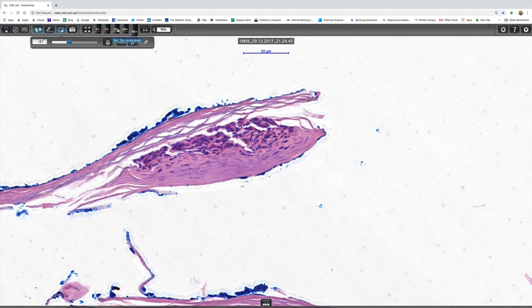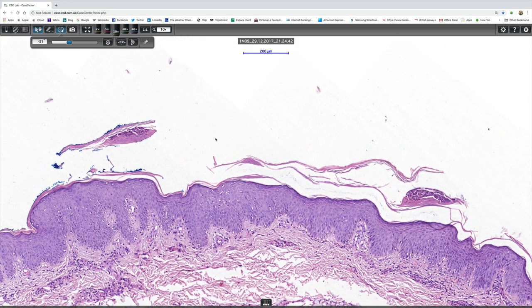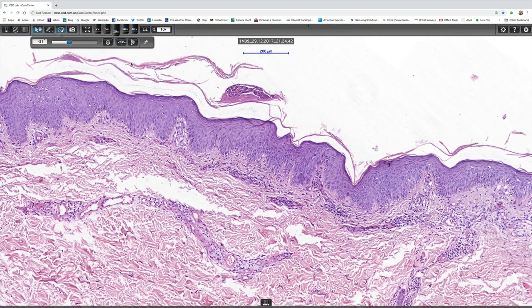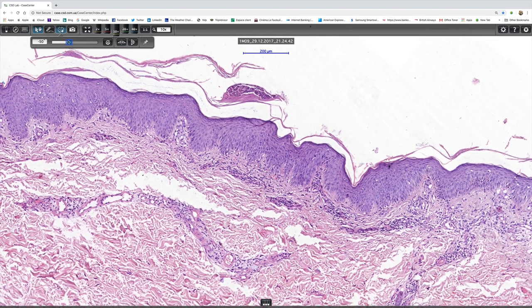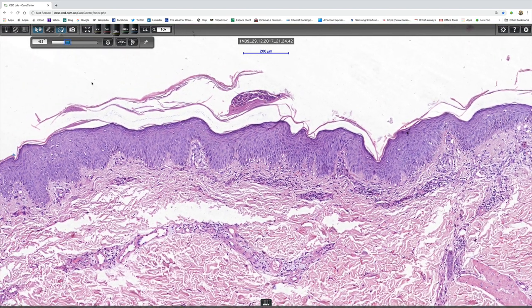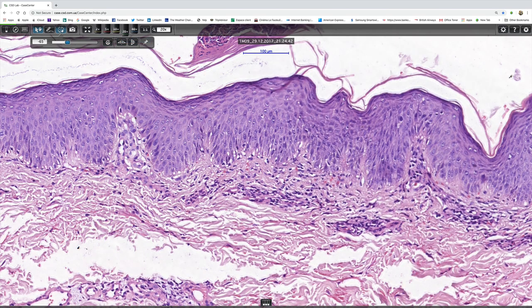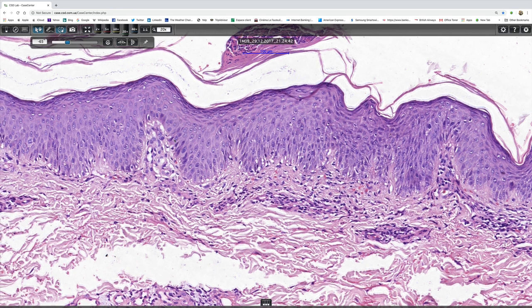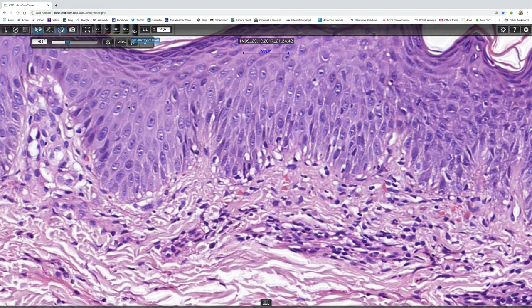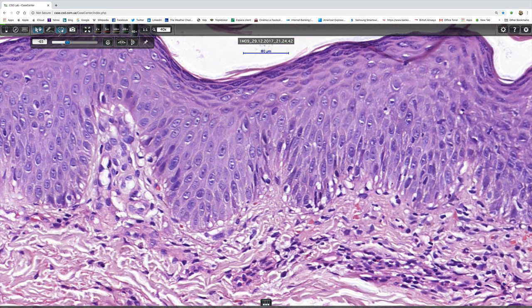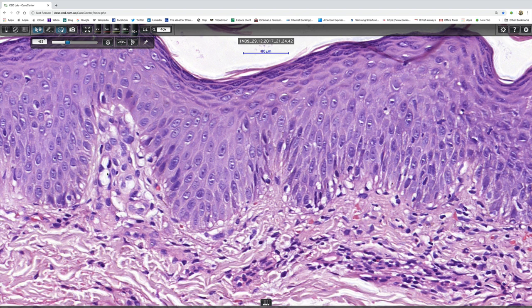And we're going to go back just to the lower power because I wanted just to have a little look at the vessels because they're an important and integral part of diagnosing any variant of psoriasis. So let's look at those at very high power. You see, that's perfect dilatation and prominence of the papillary dermal capillary loops.